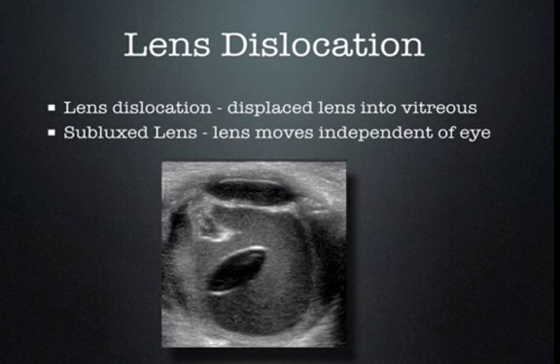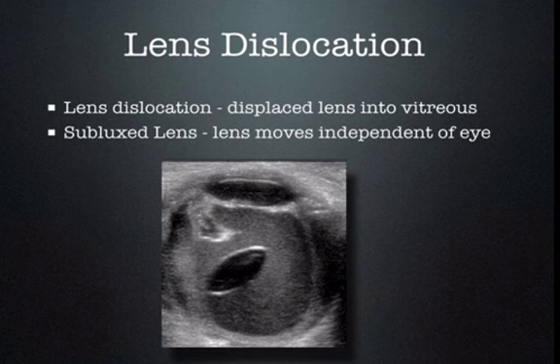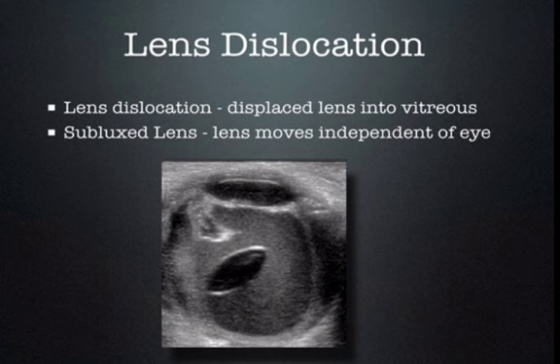Lens dislocation will occasionally be encountered. With a lens dislocation, the lens is completely removed from its apparatus and is generally in the vitreous — usually very easy to see because there's a lot of bleeding. We can see in this picture the hyperechoic blood surrounding the lens is very easy to see. A subluxed lens is more difficult to see as it is in its usual place when the eye is still, so you have to have the person move their eye back and forth — you'll see the lens move independent of the eye.